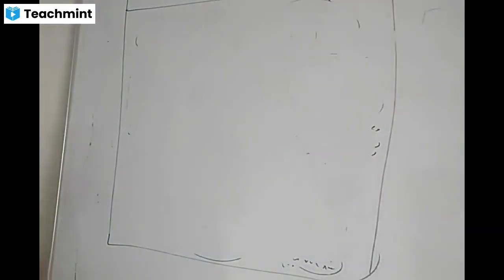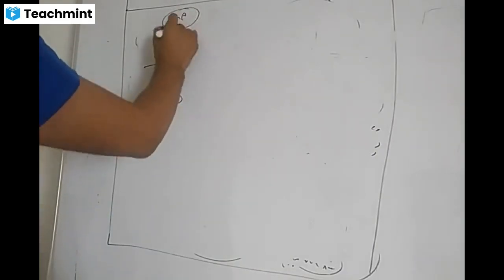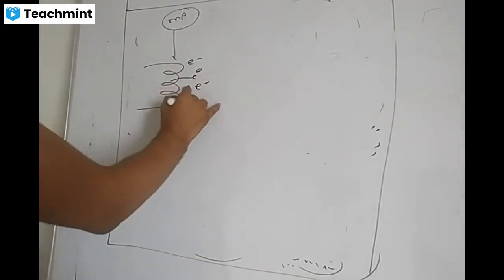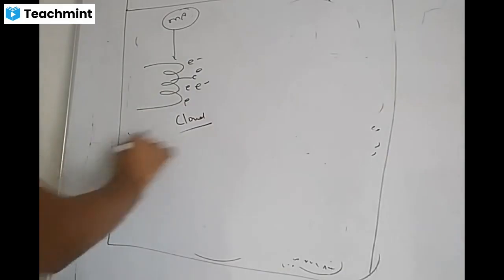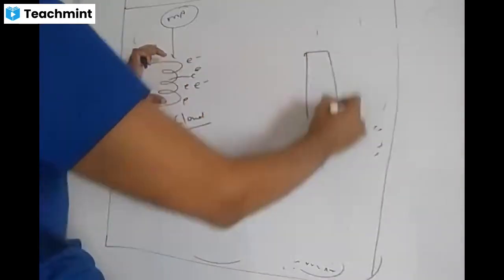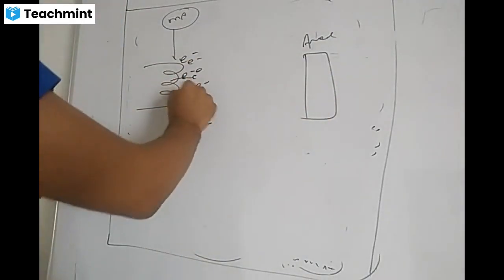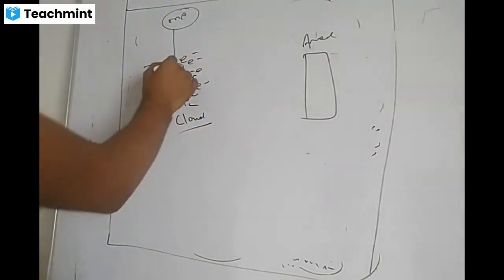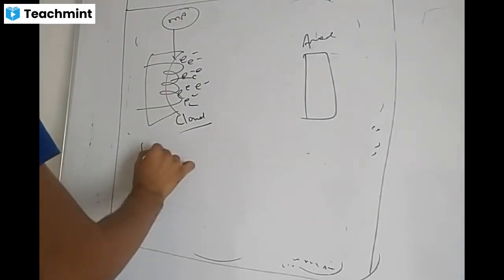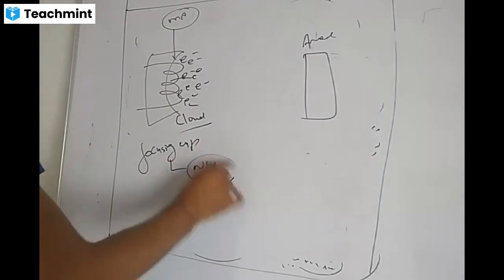At this point, this is your filament and this is your milliampere. We applied the milliampere. What comes out? Electrons. This electron cloud, we need to focus toward the anode. To focus this cloud, we need something called a concave focusing cup, made of nickel or molybdenum.